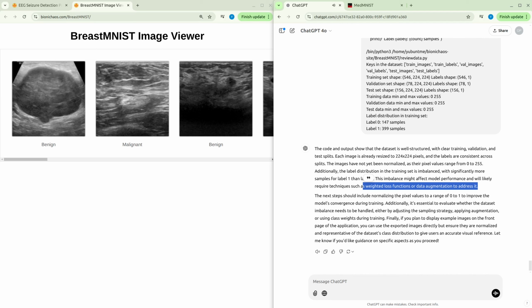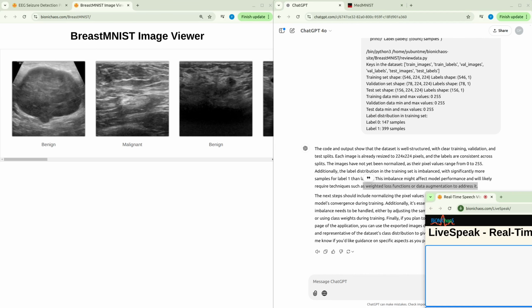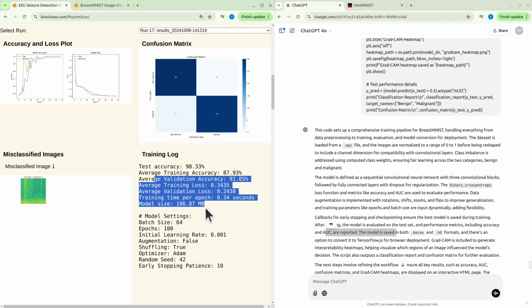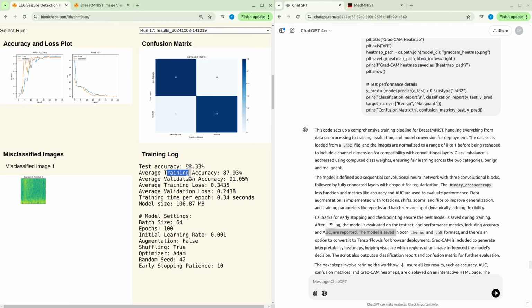Okay, we're already doing normalization in the code. I haven't shared the training code with you yet. We did test it a couple times. We had some issues with that code. In the original performance, we just did the accuracy. We didn't do area under the curve. We would definitely like to include the areas under the curve.